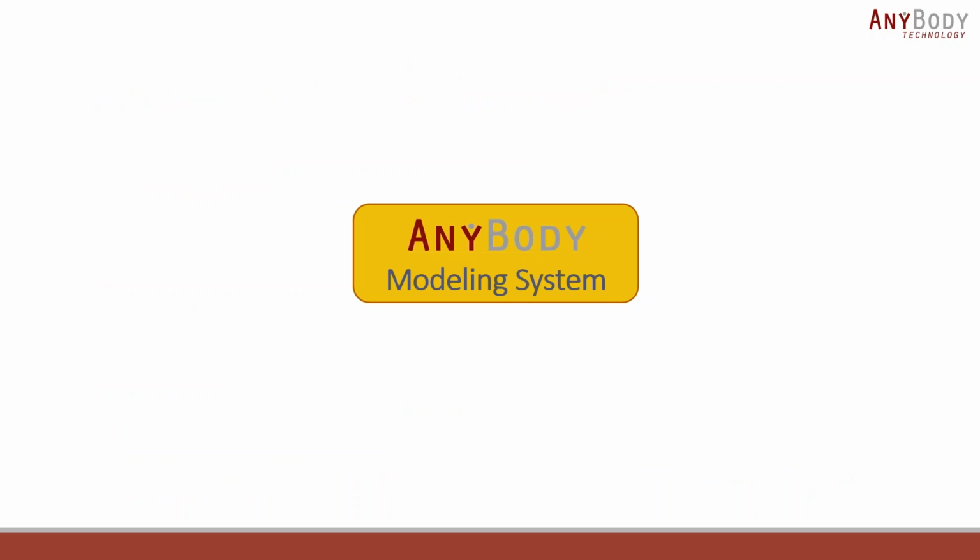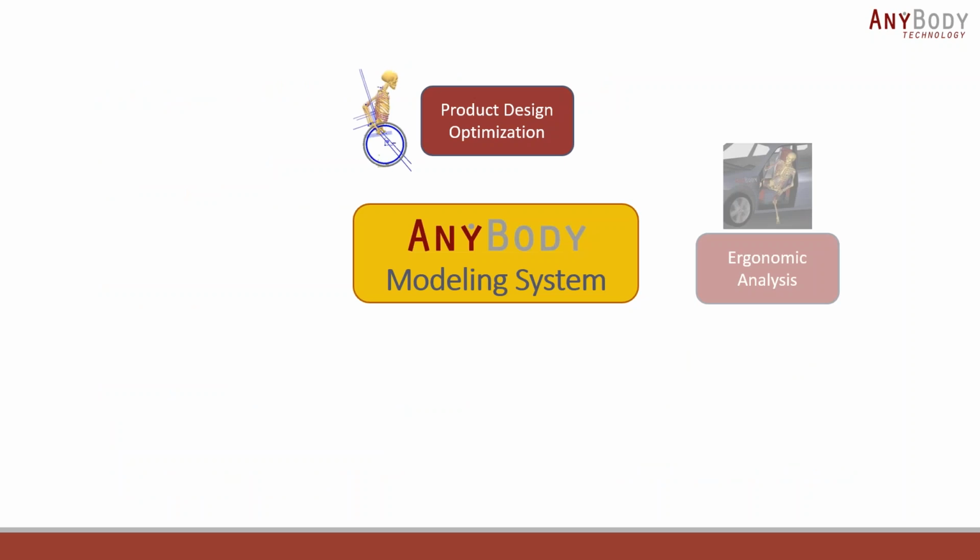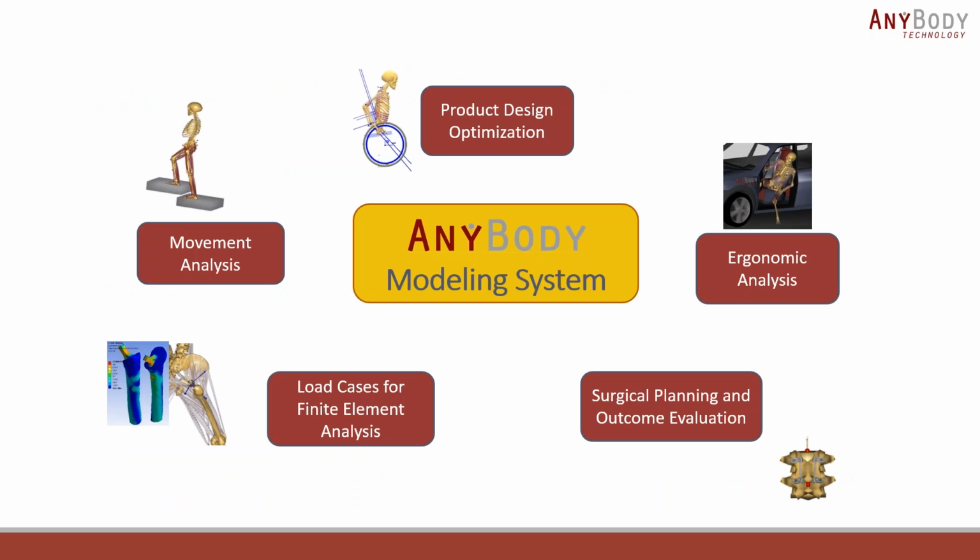So we see a wide range of applications for such software. These are classic examples of typical domains that you would see the Anybody modeling system being applied to.